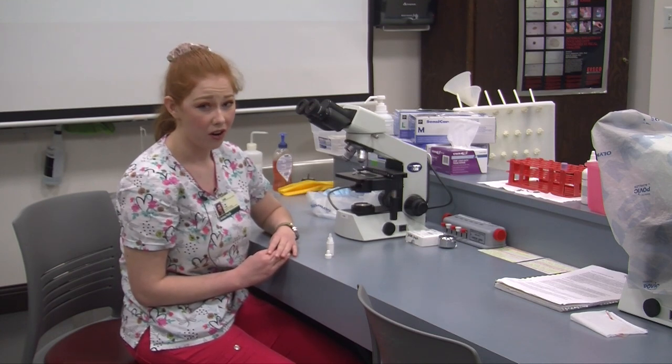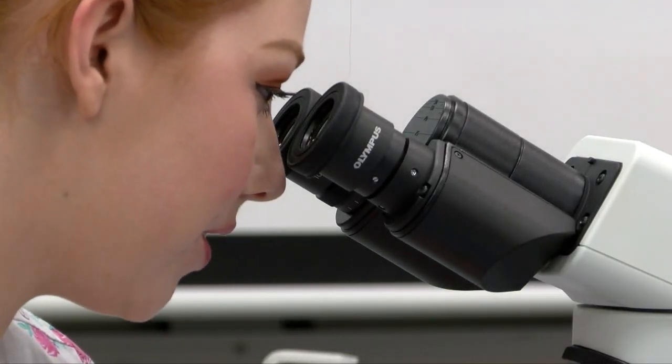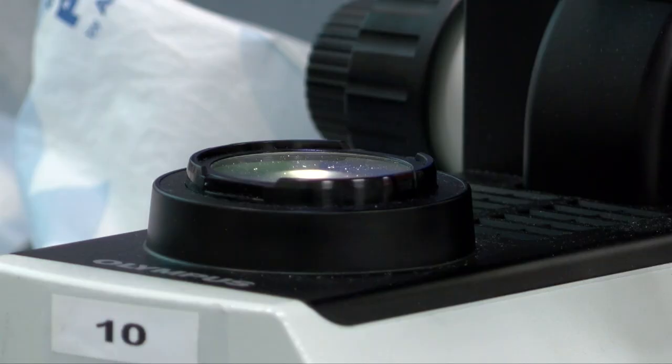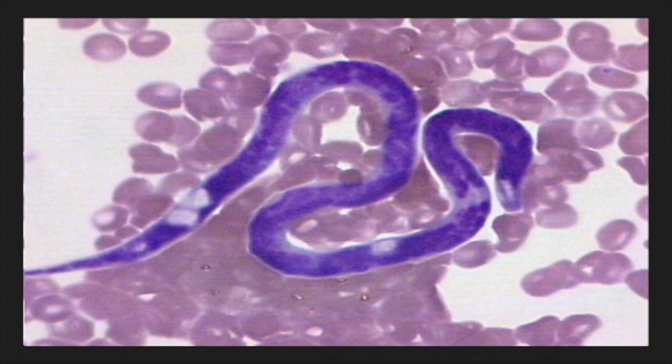Once I can confirm I can see all my cells, I want to switch back to ten times objective. I still want my condenser all the way up and bright light. Now I'm going to look for a species called Microfilaria. Microfilaria is commonly seen in the blood of the canine species and sometimes in feline blood as well. Microfilaria is associated with heartworm in dogs. Heartworm in dogs is caused by a parasitic worm called Dirofilaria amitis. When we see just one of these in the blood the dog is considered positive for Microfilaria — just seeing one makes our patient positive.